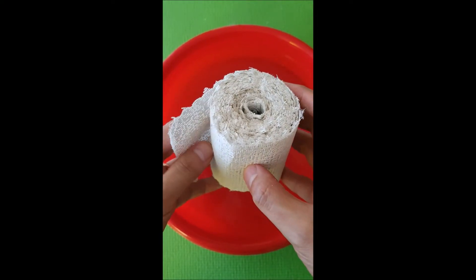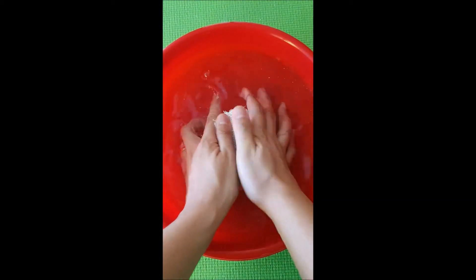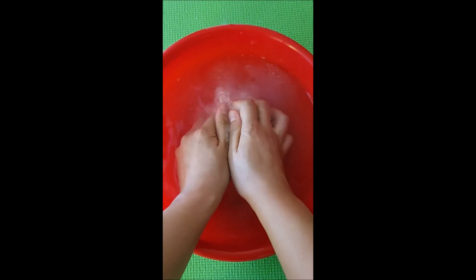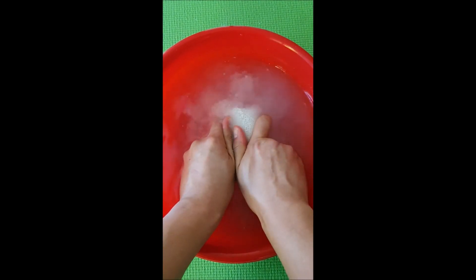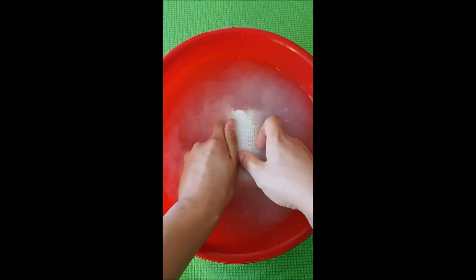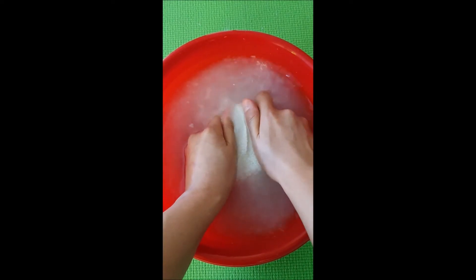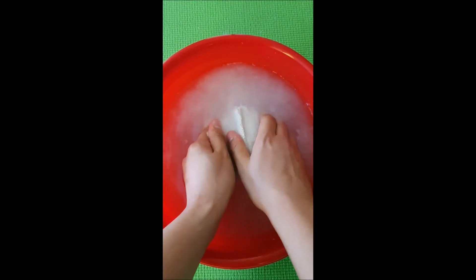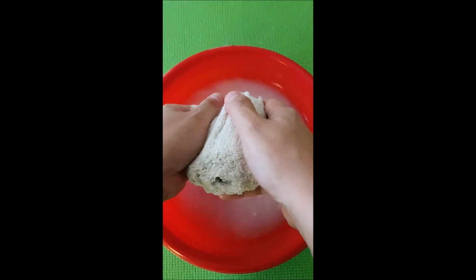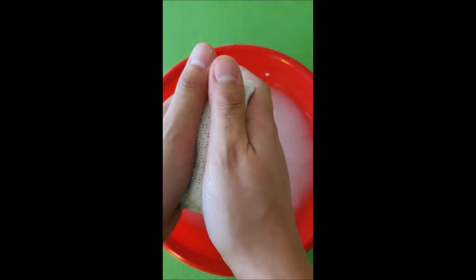To activate this plaster of paris, we need to dip it in water, making sure that all the bubbles have dissipated — that tells us that enough water has seeped through the plaster of paris. Once all the bubbles have dissipated, let it drip; don't squeeze too much or the material will fall off.